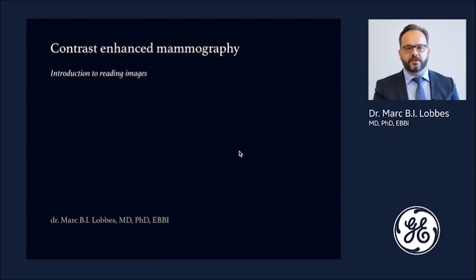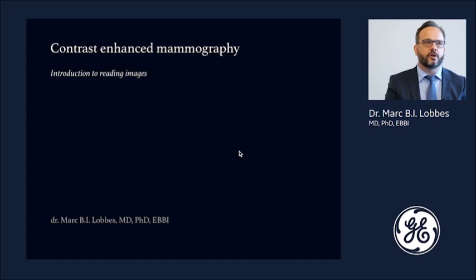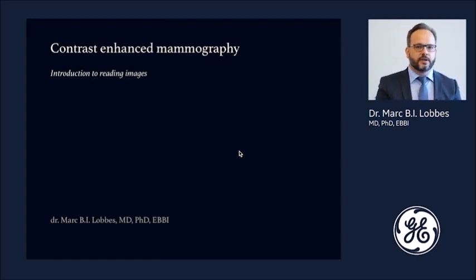I've been practicing contrast-enhanced mammography since November 2012 and have extensive experience of over 2,000 images that I viewed or reviewed, and I also am the author of several scientific publications on the topic of contrast-enhanced mammography, including several book chapters in textbooks.